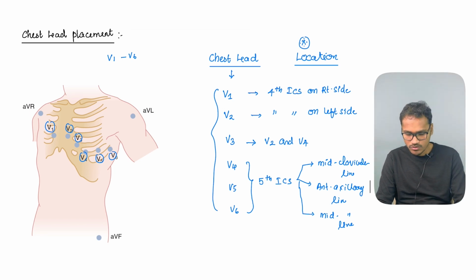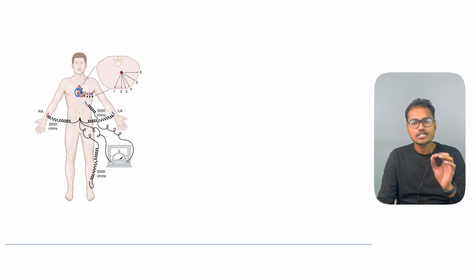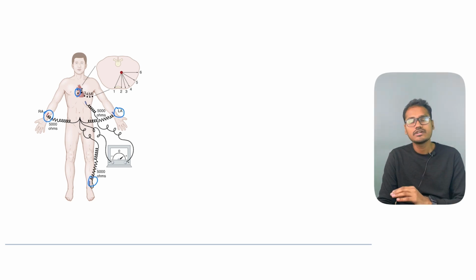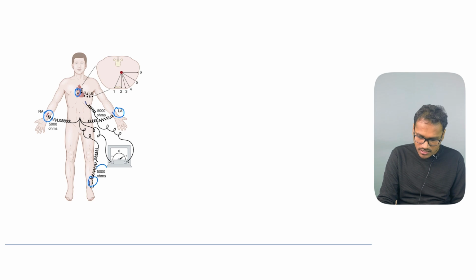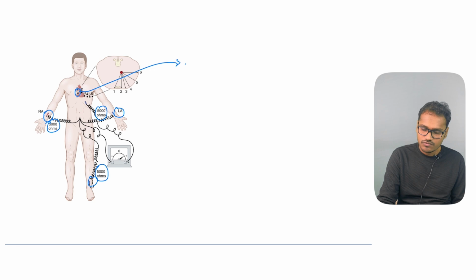So what are we going to do? We are going to construct one lead, that is the exploring electrode, whichever is placed, and the other ones which are already attached to the limb will form an indifferent electrode, coming through a high resistance voltmeter. That is high resistance, they have to pass through it, so no recording will be done. So one will be our exploring electrode, which is going to explore the values.